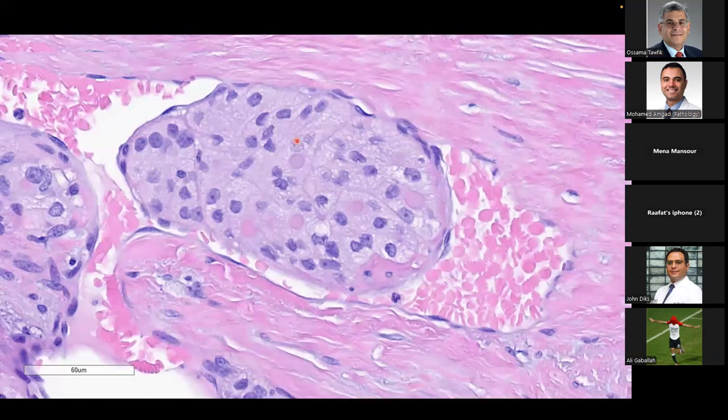Now for vascular invasion, if you thought capsular invasion was difficult, vascular invasion, or angioinvasion, is even more difficult in thyroid. There are a few different views of what to call angioinvasion. Some people say if it's attached to the wall of the vessel, if there's fibrin around the tumor, if it's wrapped with endothelial cells.